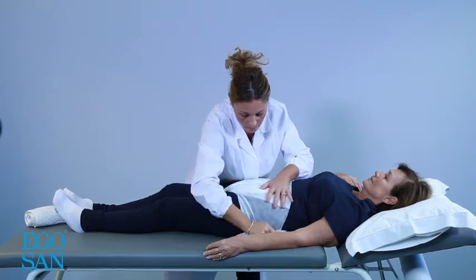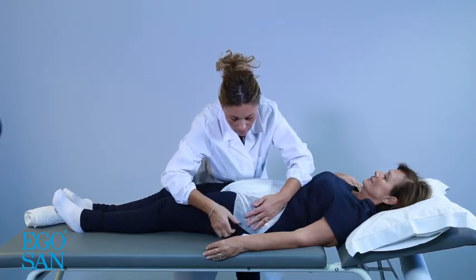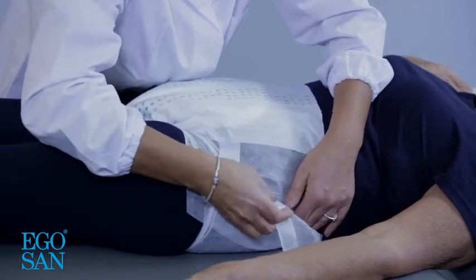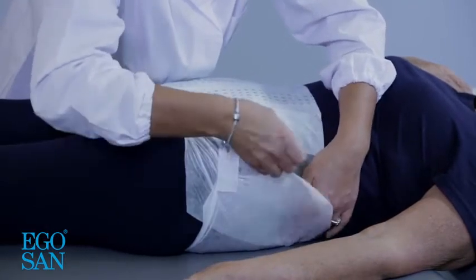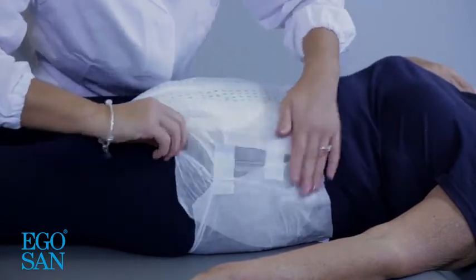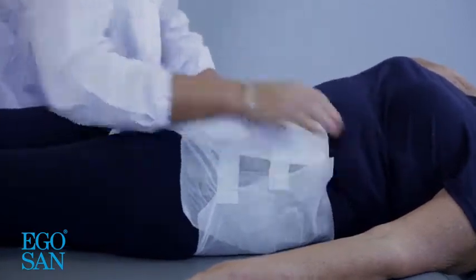Stretch out the right and left hand side tapes located on the back. In that way, it will be easier to wrap the brief around the user. Place the outer edges of the product over the abdomen, making sure that the leg cuffs fit snugly into the groin area.